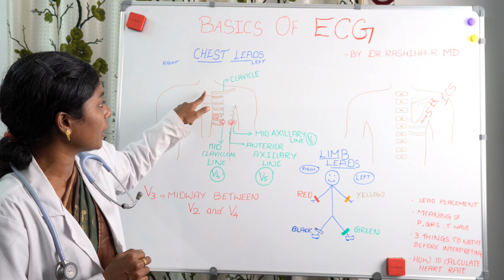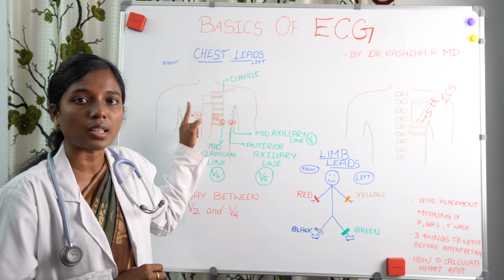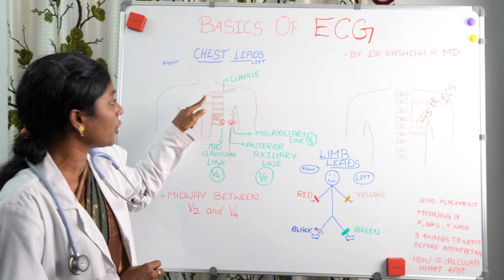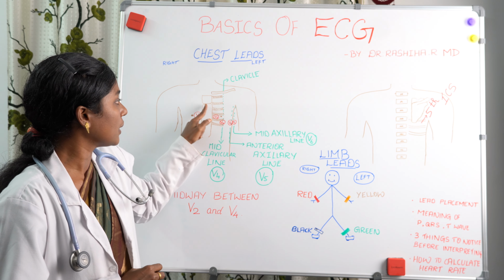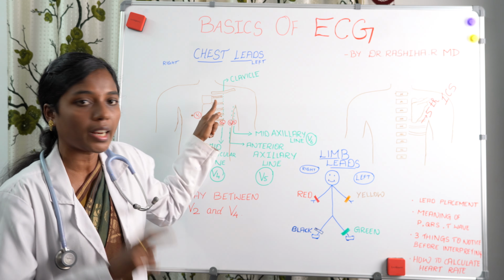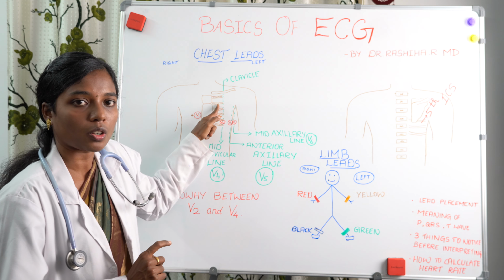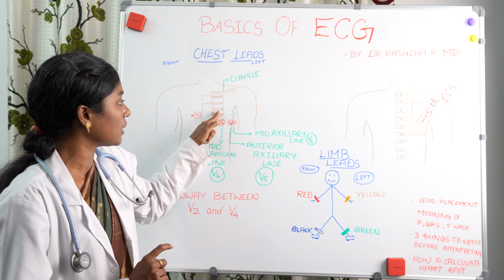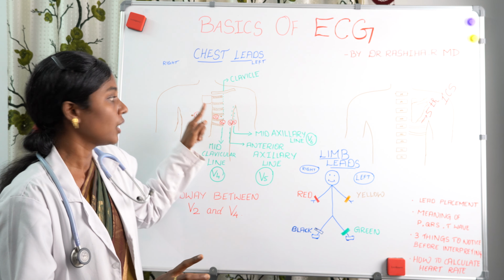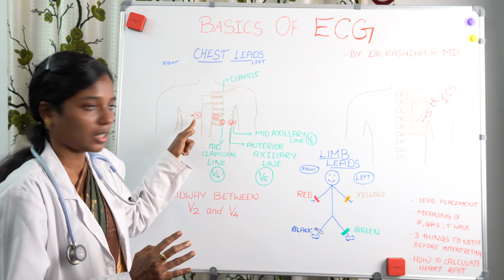First, palpate the patient, and here you will usually feel an elevation which is nothing but the sternal angle. Sternal angle is the manubriosternal joint, and the space which is just adjacent to the sternal angle is the 2nd intercostal space. Now count down from the 2nd intercostal space and you will get the 3rd and then the 4th.